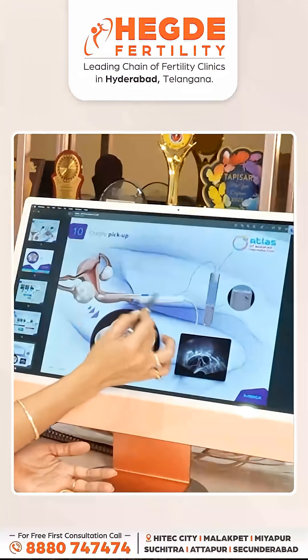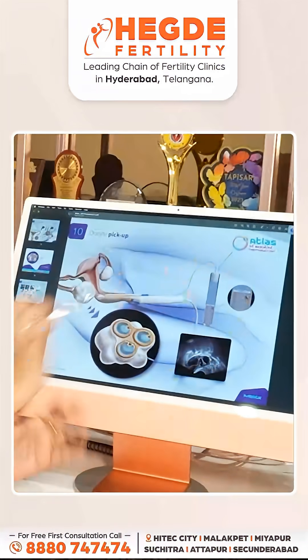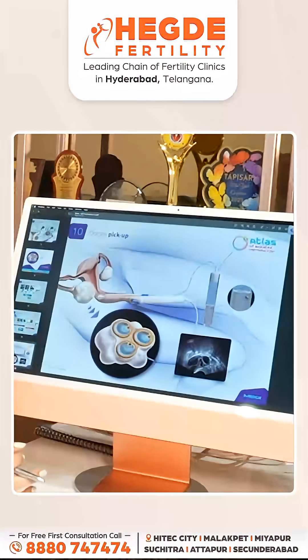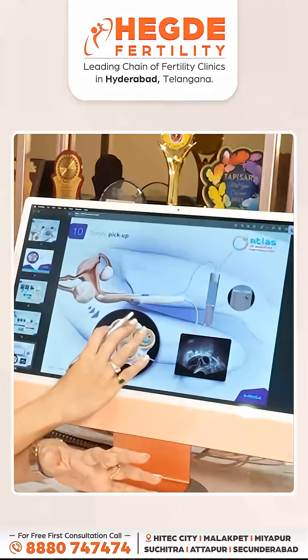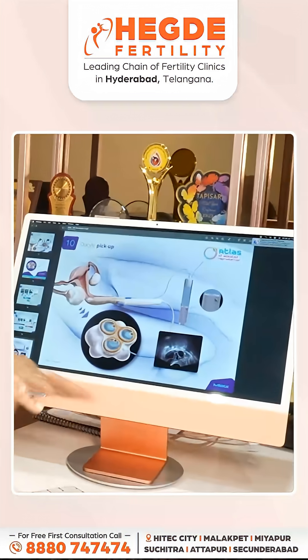When we enter every follicle, the tubing is connected to a test tube and there is a suction apparatus — vacuum aspiration using a suction pump. The fluid collected from the follicle is called follicular fluid. As we do the follicle aspiration, the tubes are sent to the embryology lab where we collect and check the fluid under a microscope.